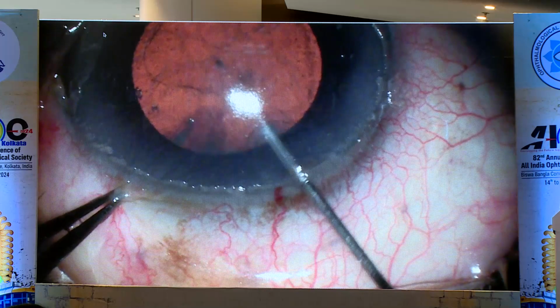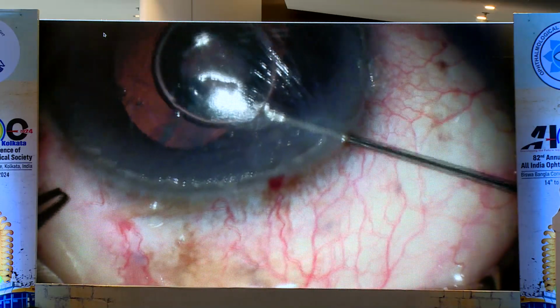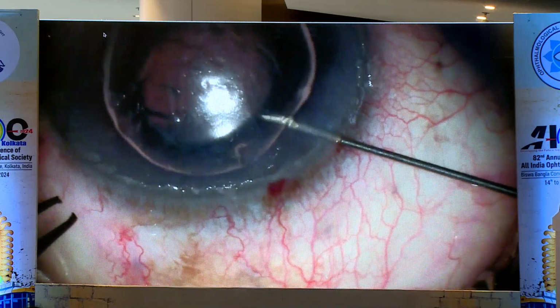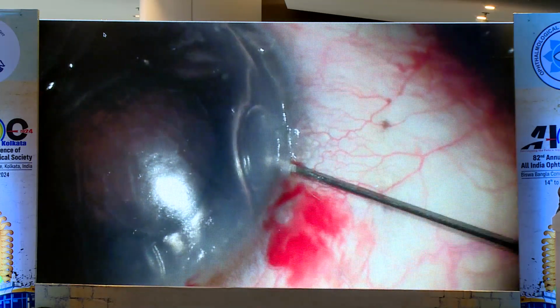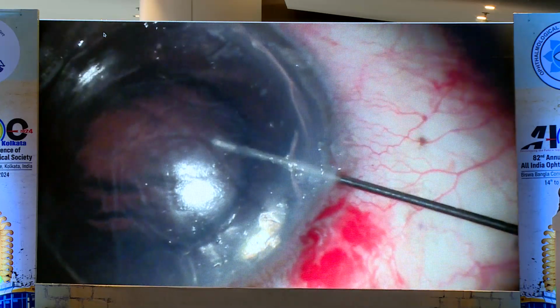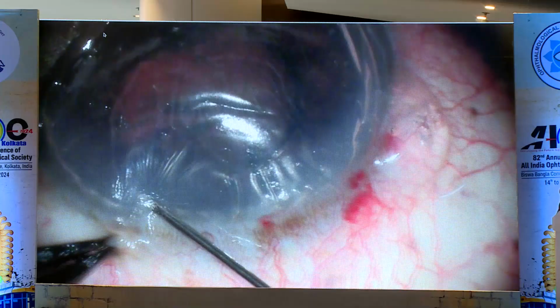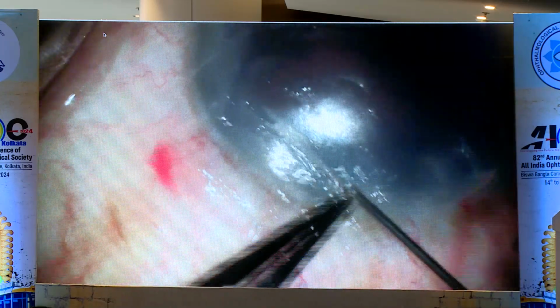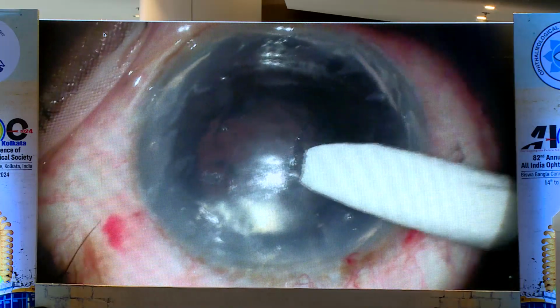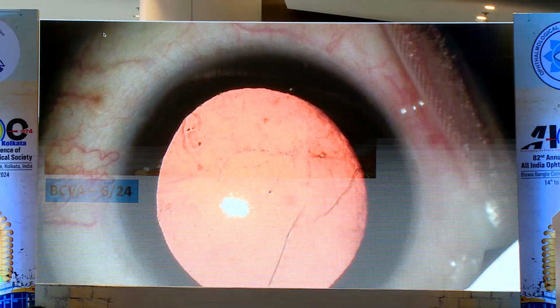This is a case referred to me. The surgeon started surgery, there was a total Descemet detachment, he identified it and abandoned the surgery. Unfortunately, the patient came 7 days late. There is corneal edema, so I have to remove all the corneal epithelium. If you continue surgery at the early stage when there is a Descemet detachment, you can damage the Descemet. There will be Descemet removal, or there will be a Descemet tear. If it is a Descemet tear, it is very difficult to manage. Then you have to go for either a DMEK or DSEK operation and make a tunnel. Just 1 minute more. You can see this is a case of NS3 cataract, the Descemet is well settled, and after 1 month you can take up the surgery. Thank you so much.